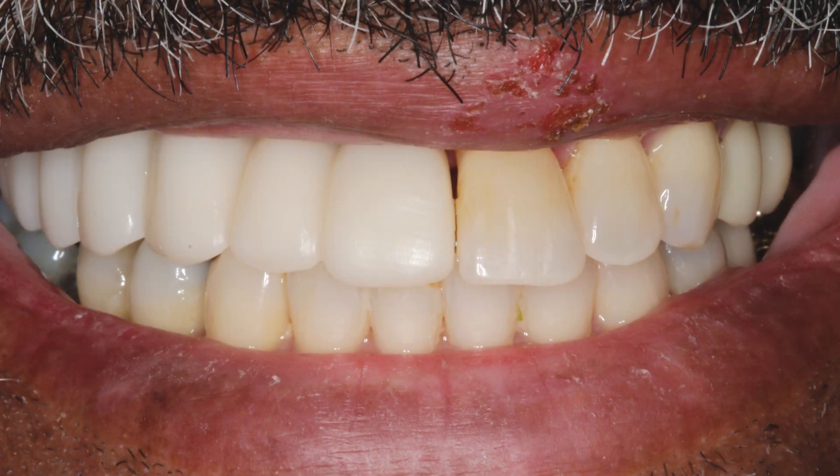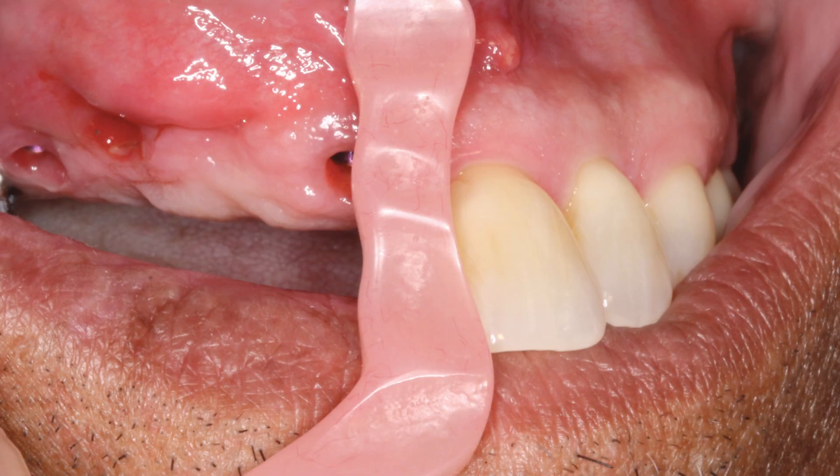Because of the excessive vertical bone loss created by the periodontally involved teeth, it was determined that the final Bruxer solid zirconia prosthesis would be designed and milled with gingival areas and pink coloring to maximize aesthetics. The gingival shade guide was used to select the proper shade for the soft tissue portion of the prosthesis.